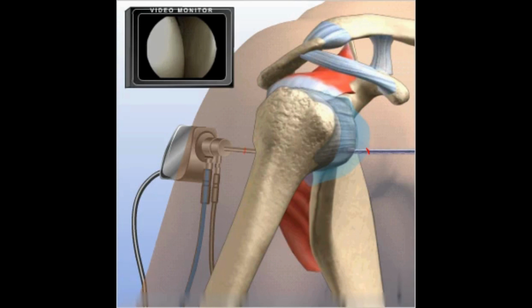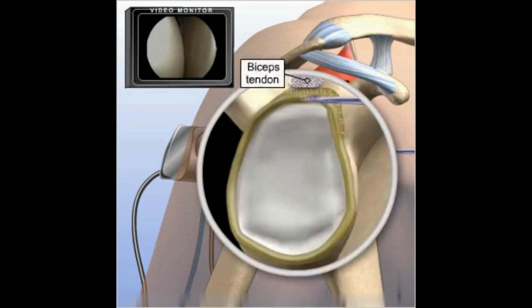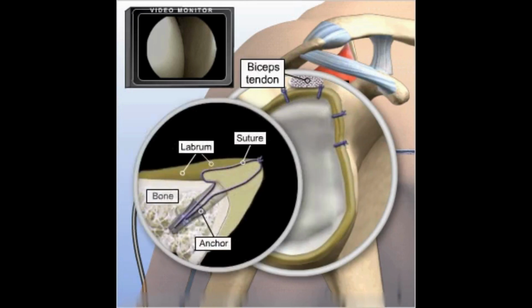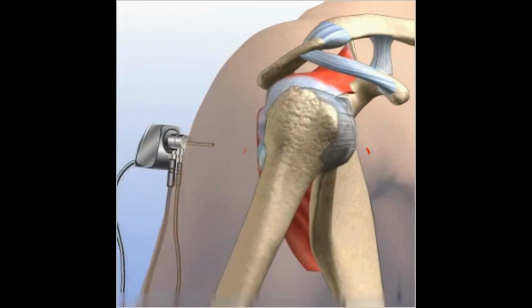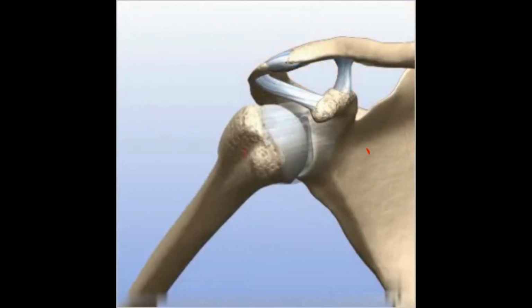A surgical instrument is inserted into the joint. It will be used to reattach the labrum to the glenoid using suture and anchor-like devices. After the labrum is reattached, the surgical instruments are removed and the procedure is completed.